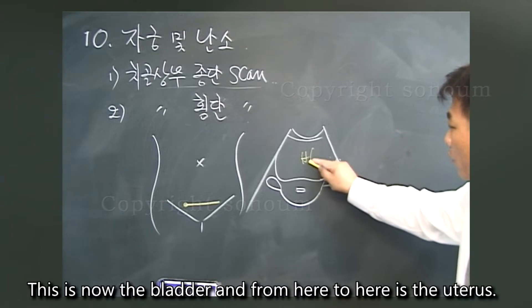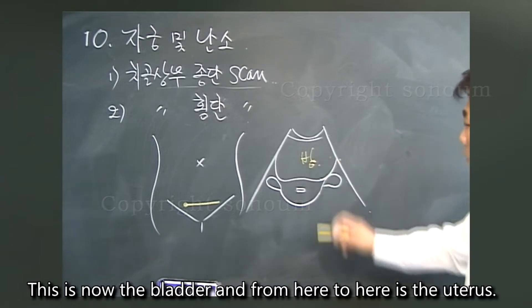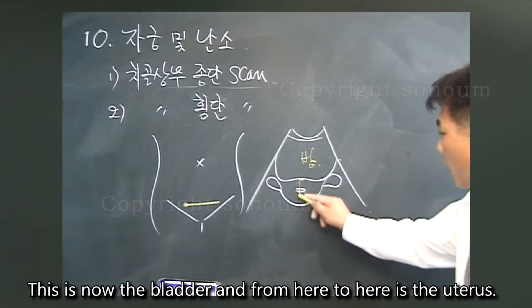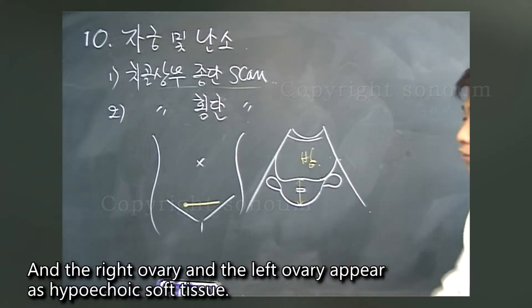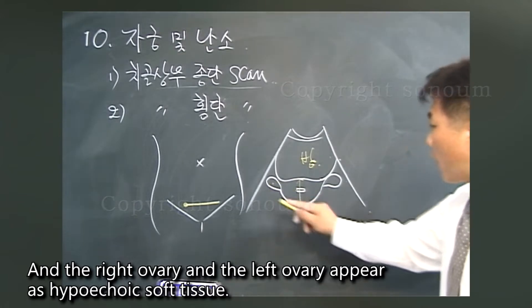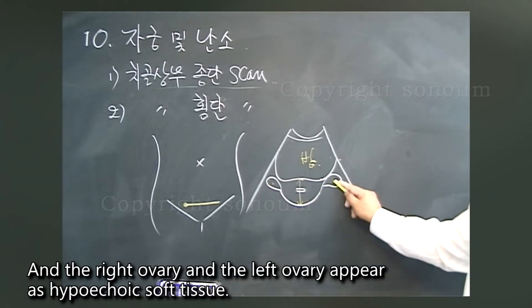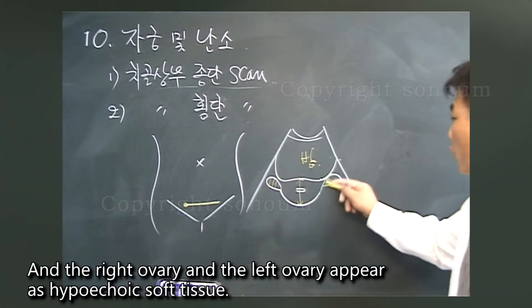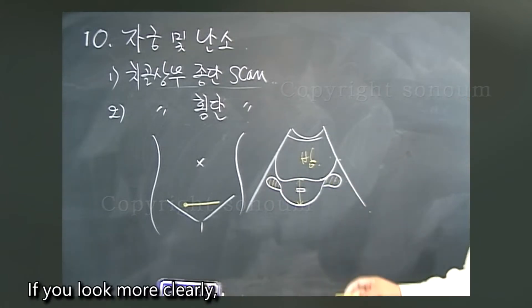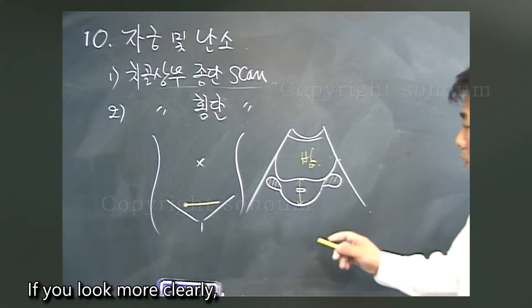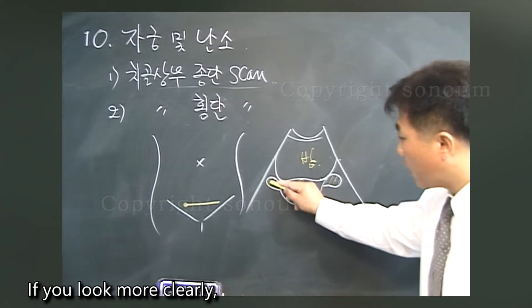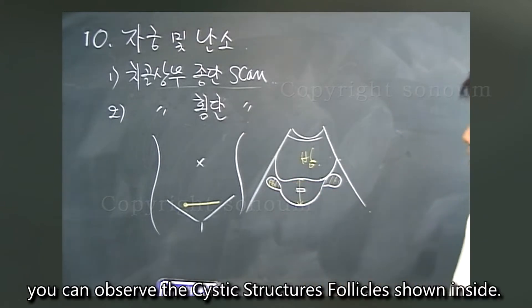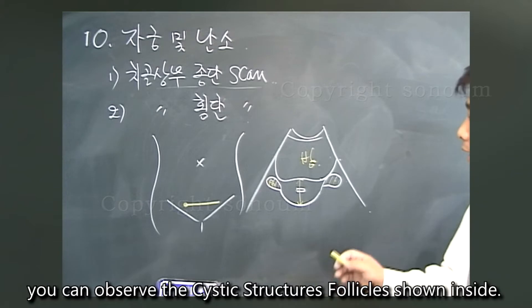This is the bladder, and from here to here is the uterus. The right ovary and the left ovary appear as hypoechoic soft tissue. If you look more clearly, you can observe the cystic structure's follicles shown inside.